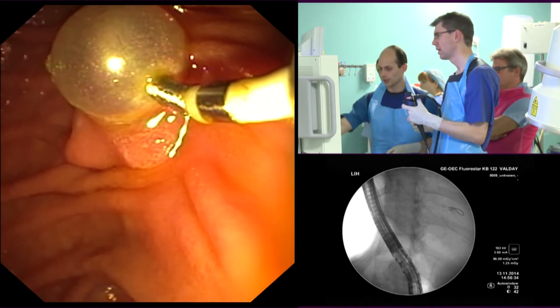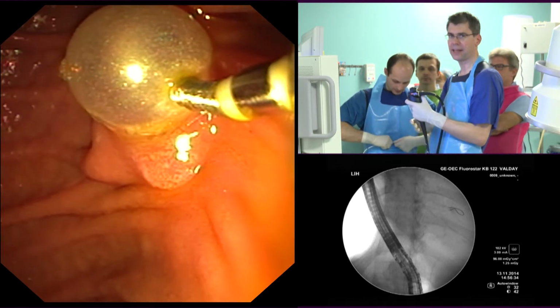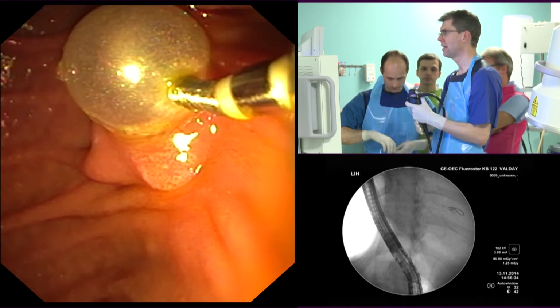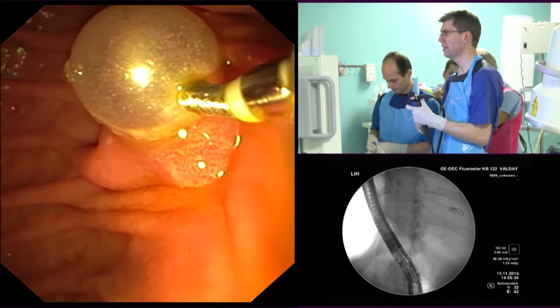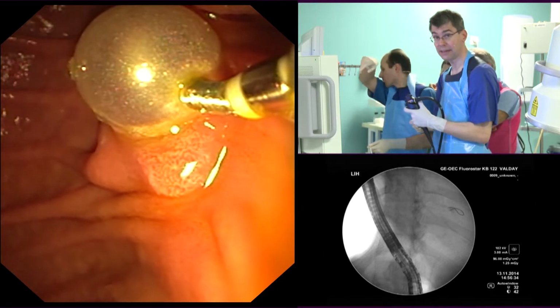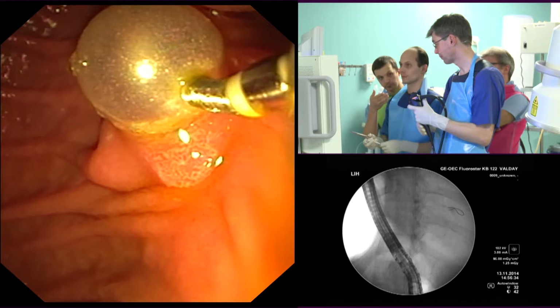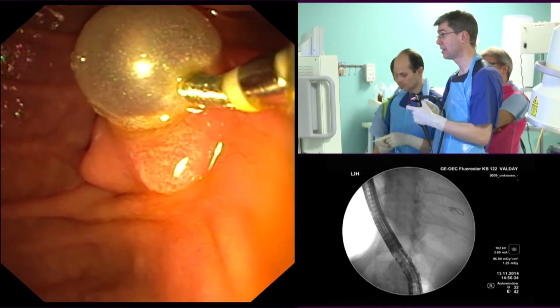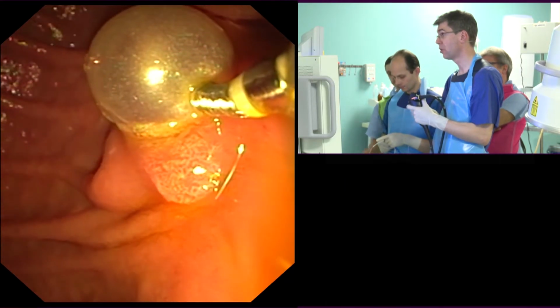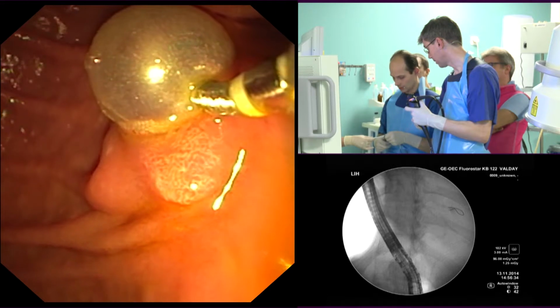You can easily see how complex and delicate the procedure this is, and this is the reason why it's done in selected patients and in very proficient centers, as this is one. And we've done this procedure quite a number of times here, but it's sometimes a little bit cumbersome to work with this tiny equipment.